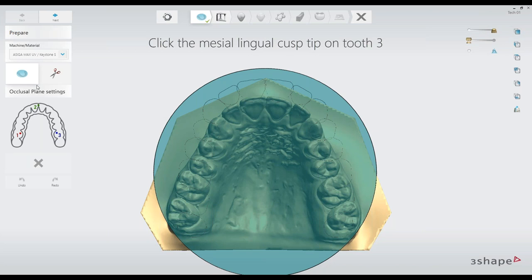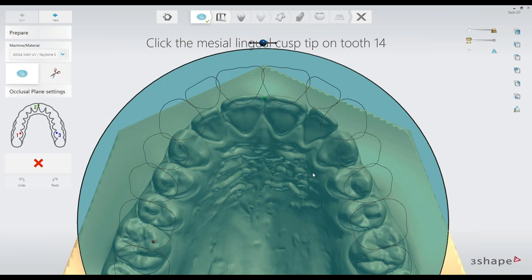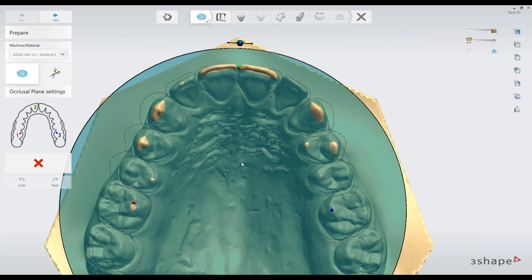Following the steps, there are a lot of helpful tips along the way. It tells me to click on the mesial lingual cusp tip of number 3, so I click my first point. Then it tells me to click where the mesial incisal edges meet in the incisal, so I click right there. Then mesial lingual cusp on number 14 — and the software places my occlusal plane. Pretty simple. We've done that, so we're going to say next.